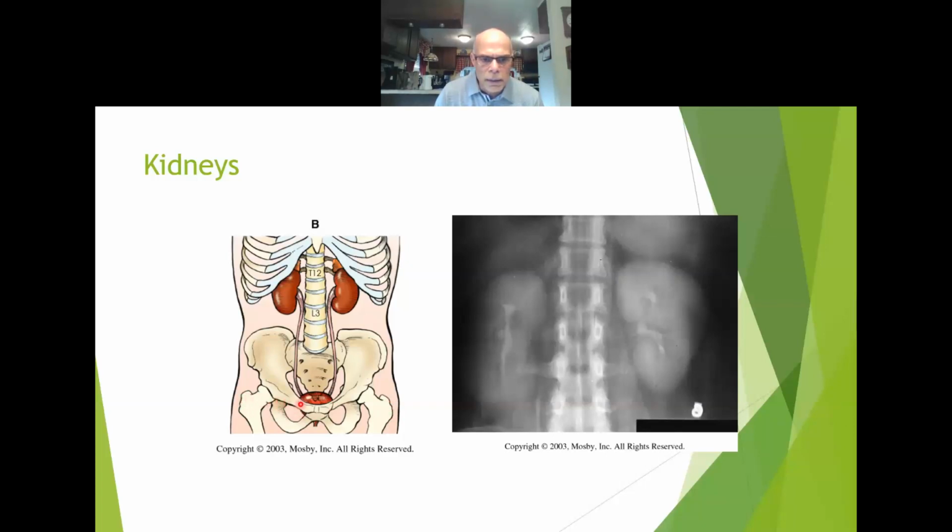Look what it lines up with, right there. The most prominent knot of it, right there. If you palpate, you're going to hit right there. We're going to cross over and we hit the pubic symphysis. Therefore, you don't really have to touch the patient if you're uncomfortable doing so.